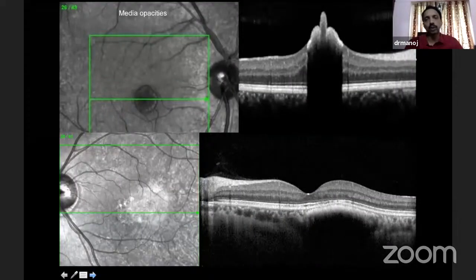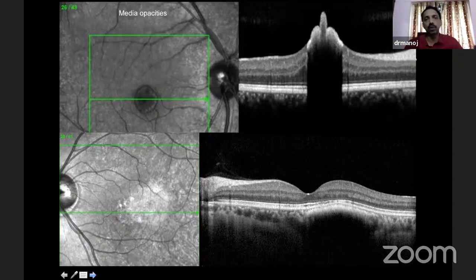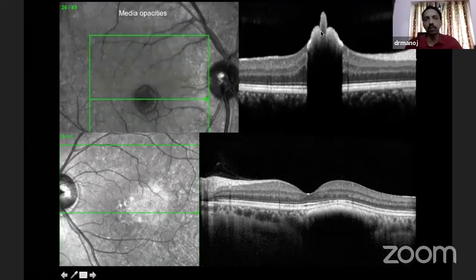Because it uses light, whenever there are media opacities, those opacities are going to obstruct the light entry and therefore you cannot see the underlying tissues. As you can see in the top slide, there is some kind of lesion sitting on top of the retina which is not allowing the light to pass through, so you don't see anything underneath it.